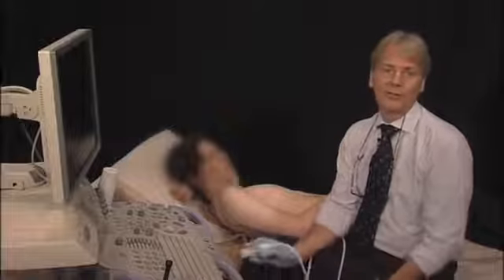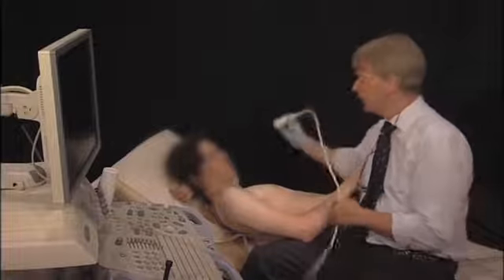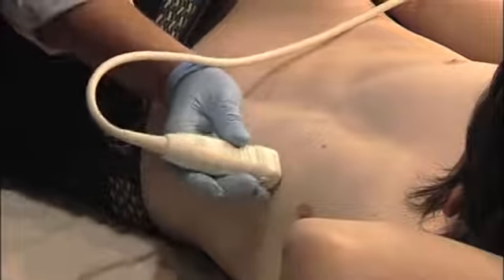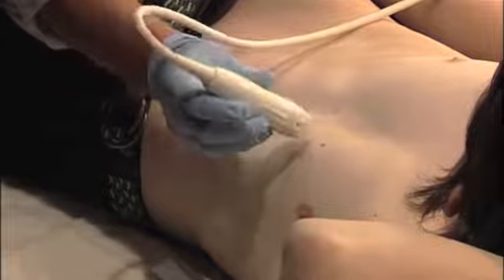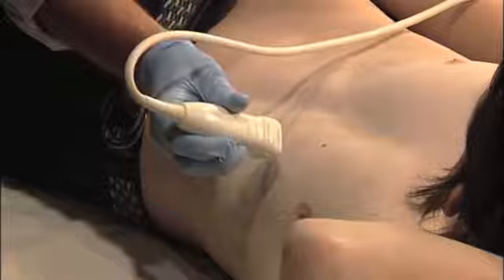So how do you hold the transducer? Well, I guess everybody does it a bit differently, and I will just show you how I would hold the transducer. The first thing which is of importance is that you hold the transducer low and not high. Thereby you have more stability and more control over your motion. The second thing is remember where the marker is. You have a little marker here, and with my finger I can feel the marker.